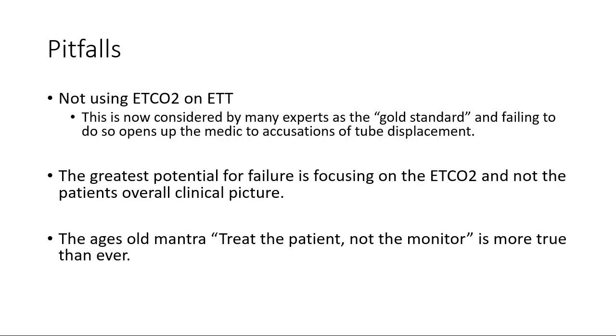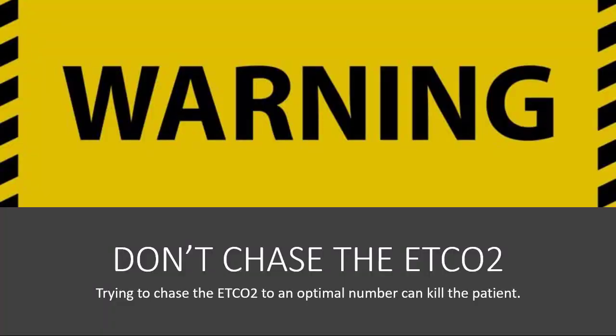So that goes back to treat the patient, not the monitor. I would not say treat the patient, not the monitor. I'd say treat both the patient and the monitor holistically. Wrap it all together. And finally, don't chase the number. Don't chase the end-tidal CO2. Trying to bag them down or bag them up will cause physiological changes throughout the body that are not good.